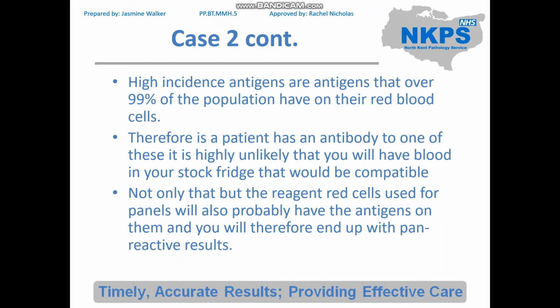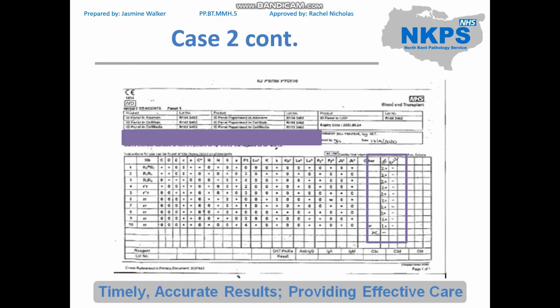So having looked at this, what happened was an antibody panel was put on at the same time as the patient's blood group, and the BMSs attempted to get through to the ward. Unfortunately, the doctor who was looking after the patient wasn't around, so we were told we'd be phoned back.